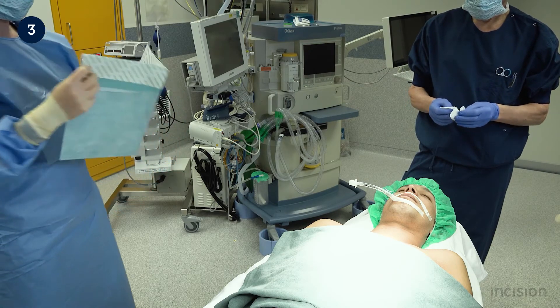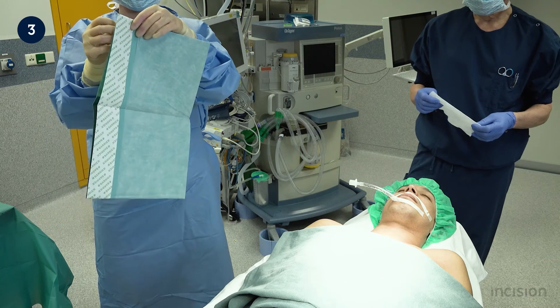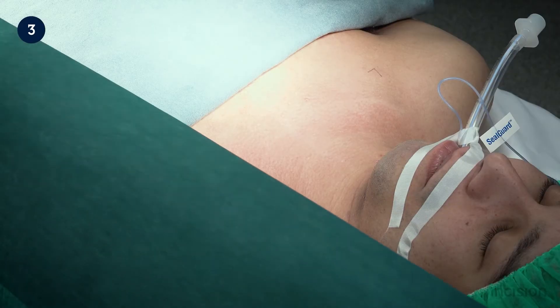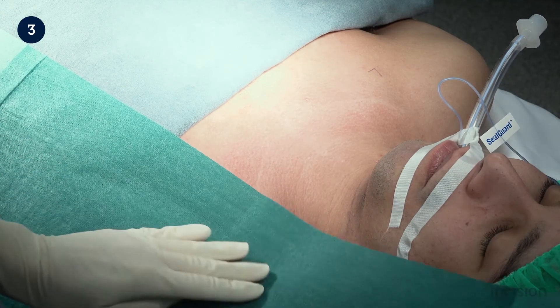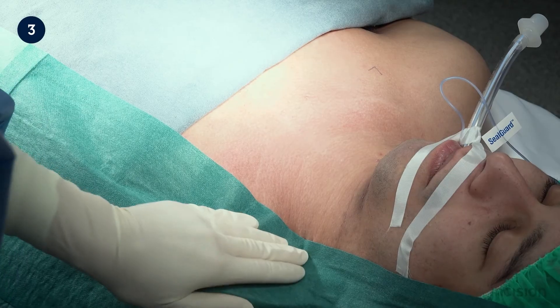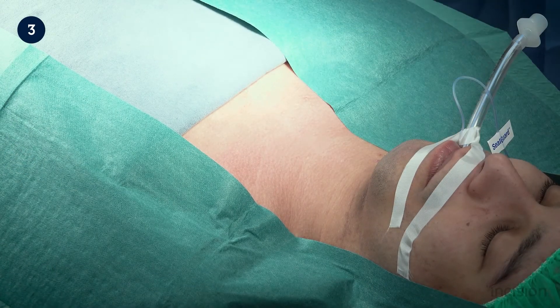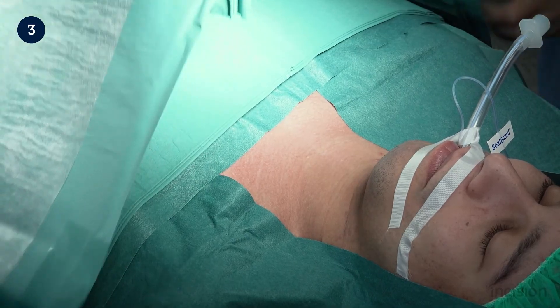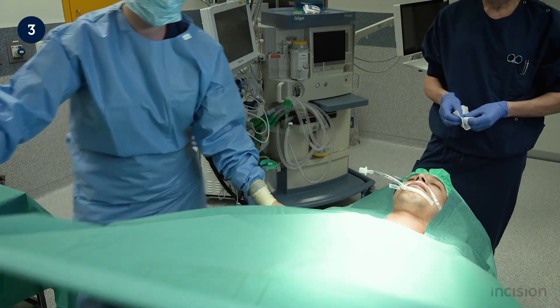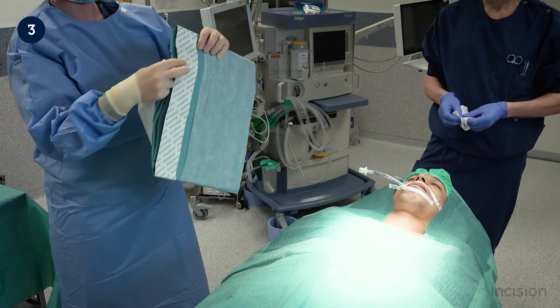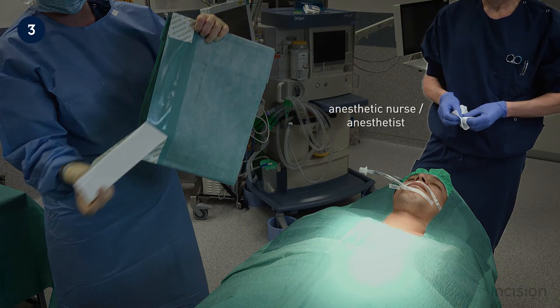As with the abdomen previously, a square draping configuration is used. Take note of how the scrub nurse remains aware of her surroundings as the first small drape is handed to the surgeon on the opposite side. It is unfolded and applied to the patient as shown. Take note of how slow, firm movements are used to secure the drape onto the patient and adjustments kept to a minimum. The second drape is positioned by the scrub nurse in the exact same fashion. The third drape is a large drape and is put into place by both the surgeon and scrub nurse, then unfolded to expand the sterile field.